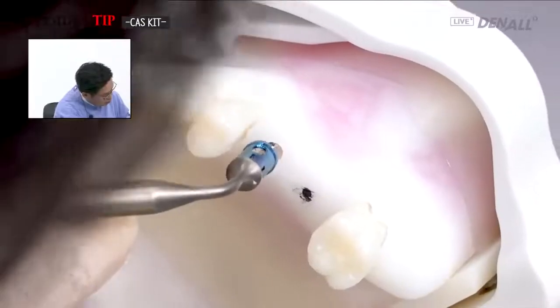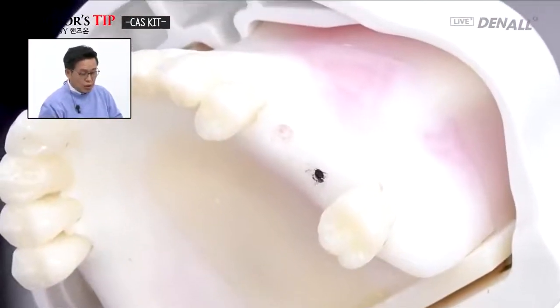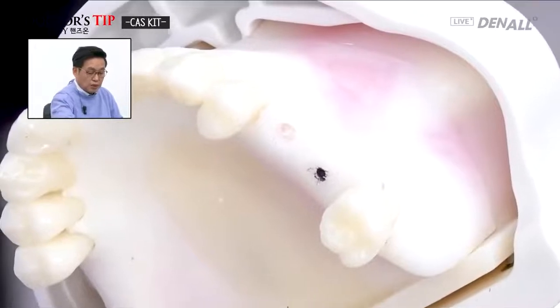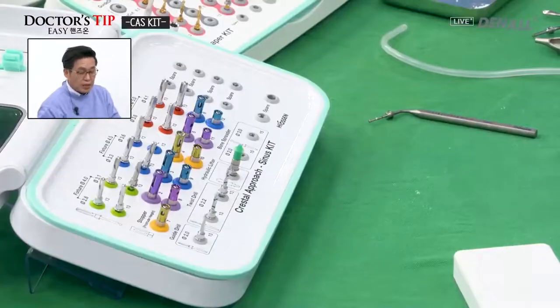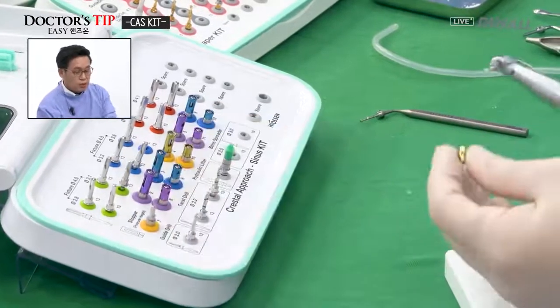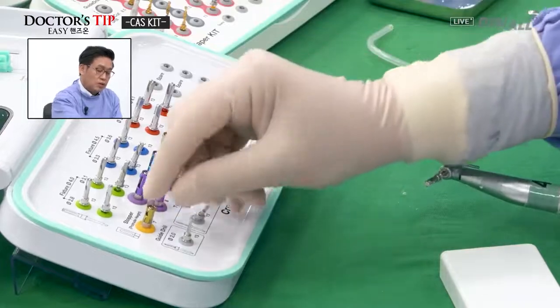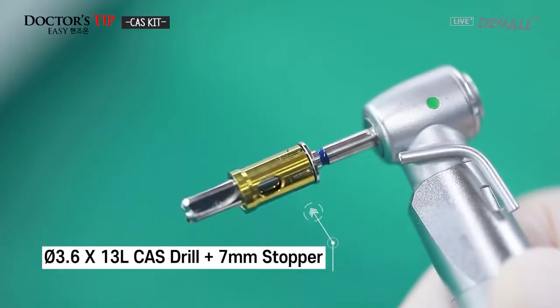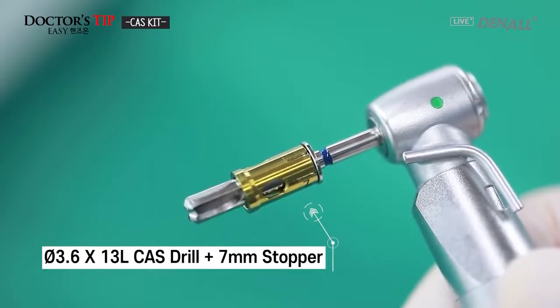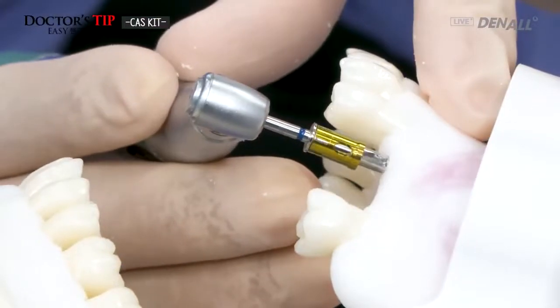The residual bone height is 5 millimeters, but there's a slope near the adjacent tooth. Therefore, we need to go a little bit deeper than we expected. The final drill is 3.6. The drill diameter is not to be increased. The 7 millimeter stopper is used for the drilling. Seven millimeter stopper.